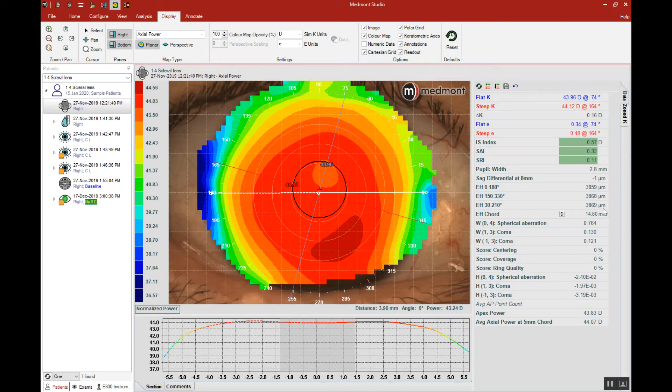That's the starting scleral lens sagittal depth that I should choose from the diagnostic set. So this attribute is going to help you to quickly and efficiently choose your initial scleral lens.